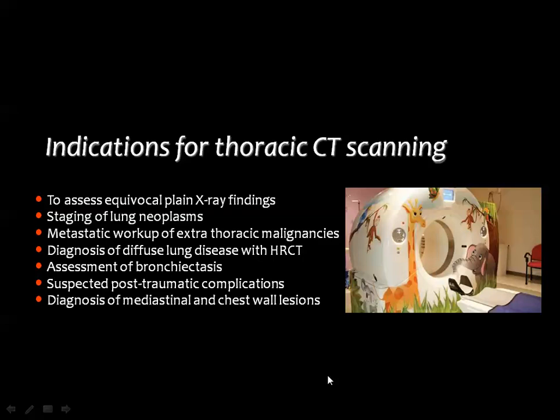So I will emphasize the essential needs for the CT scan in the pediatric age group whenever we are examining the chest, and I will show you the value of the chest X-rays as well as the value of CT whenever it is indicated.